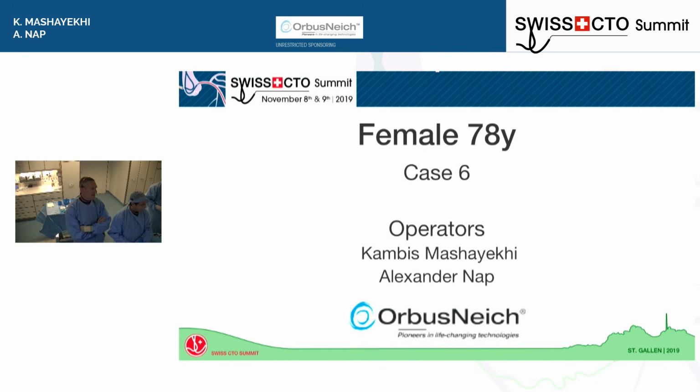Yeah. So Johannes will give you the case presentation. It's a post-CABG patient, a very nice lady. Okay, Johannes, please. Hello, everyone.